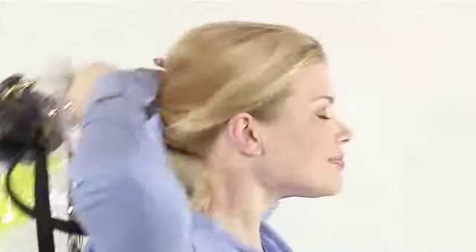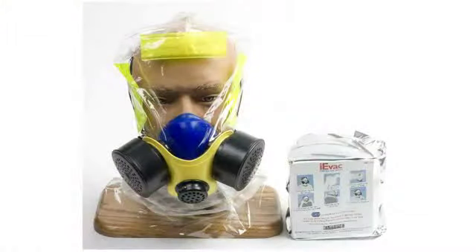Pull the iEVac over your head. After use, dispose of the iEVac in accordance with the recommended procedures or any applicable regulations.